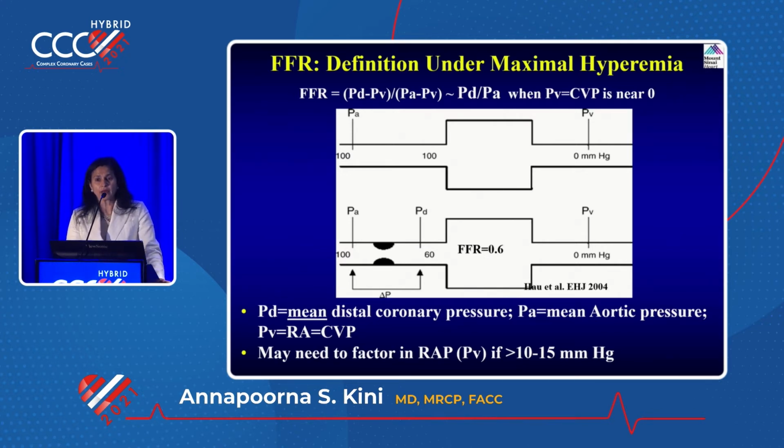I don't know whether they'll ask you specific questions on how you do an FFR. Most people probably have done FFR by now, right? You have to leave the wire a few millimeters further down, wait, then start the adenosine, do a nice pullback. All these things they may ask. So make sure you learn the technique in case they ask you any questions related to that. But number wise, you have to know that. What is the number for CFR?